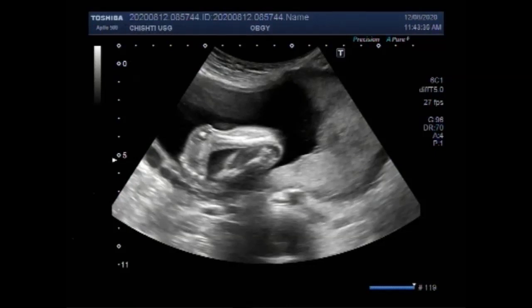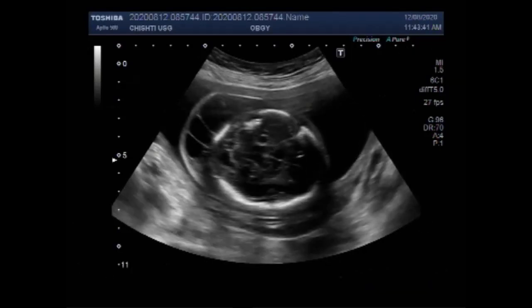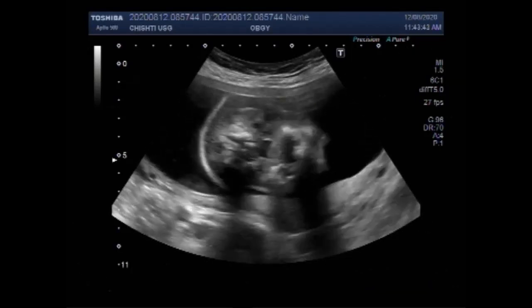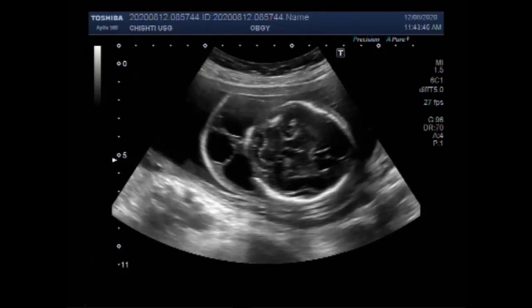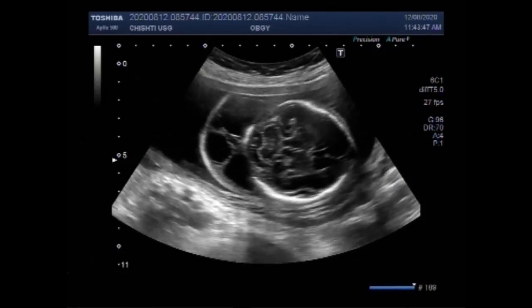This ultrasound video shows multiple fetal anomalies including clubfoot, encephalocele, kyphosis, and placental mass.